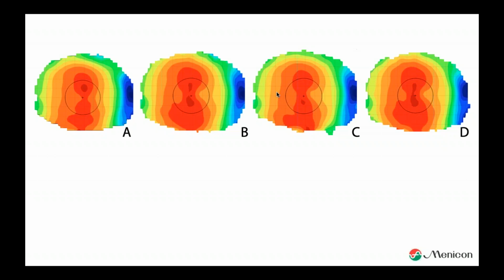So what we suggest is to do four measurements and compare those four measurements. And if those four measurements are the same, well, perfect. Move on. If they are not the same like this, you have a problem, probably a tear film problem. The tear layer is not stable enough. So what you see here is that only 50% of the measurements look like each other, but that's not enough. We want the majority.